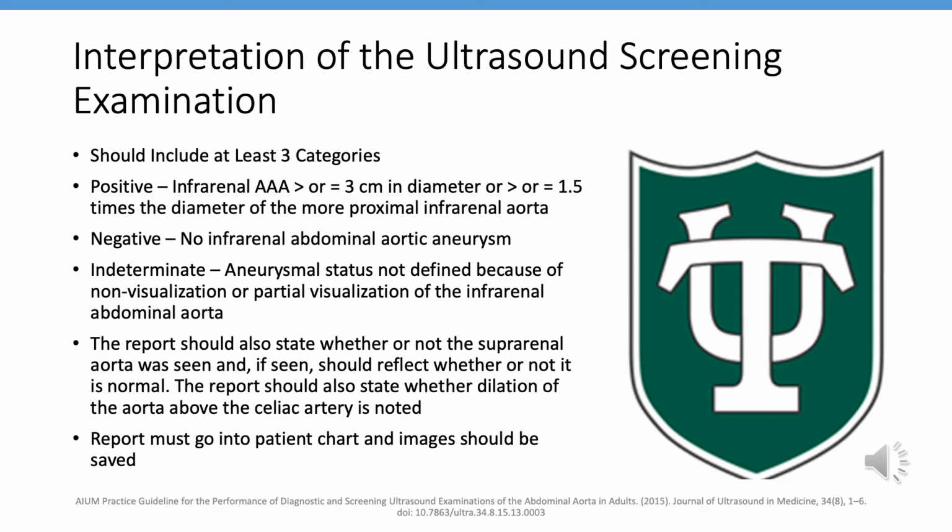The American College of Radiology also recommends that the report state whether or not the suprarenal aorta was noted and whether or not it is normal. The report should also state whether the dilatation of the aorta above the celiac artery is noted as well. The specific reference for this information is noted at the bottom of the slide.